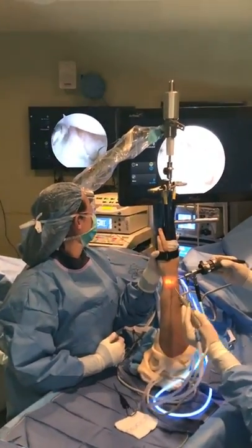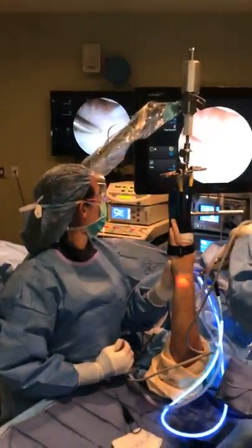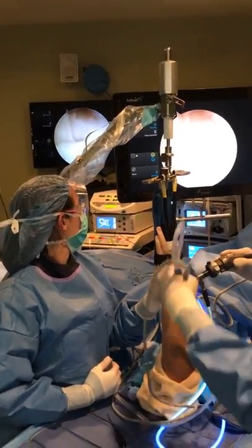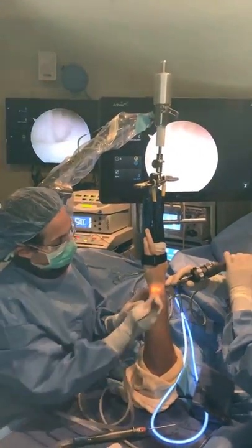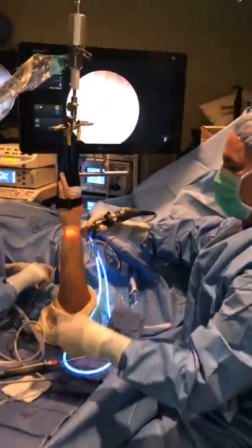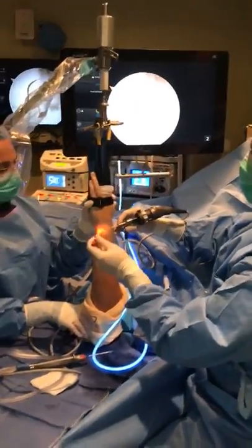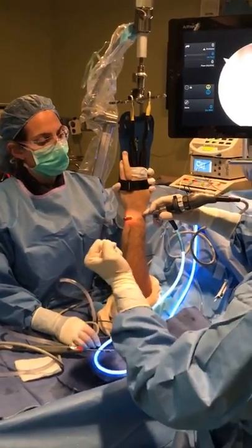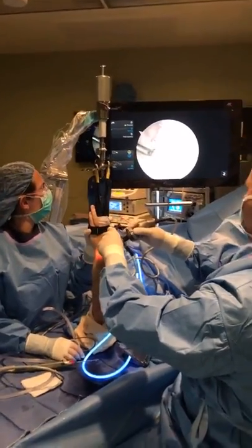So some of my colleagues I'll be with in Europe believe that you need to attach this down to the bone. Myself and others feel that a repair to the capsule will suffice. I make that decision clinically, meaning when I examined the patient yesterday, he flew in from South America, probe first please, and I determined that he did not have an instability, meaning the ulnar bone relative to the radius bone was not unstable. But there's no question, this is what we call a loss of trampoline effect.